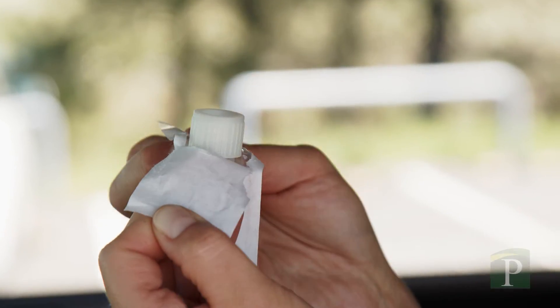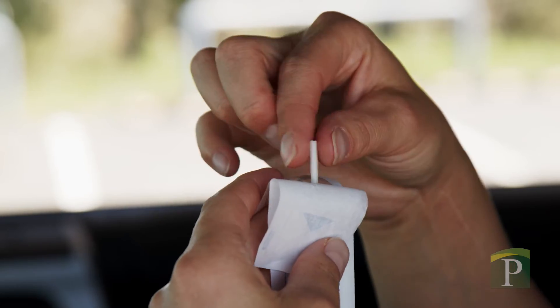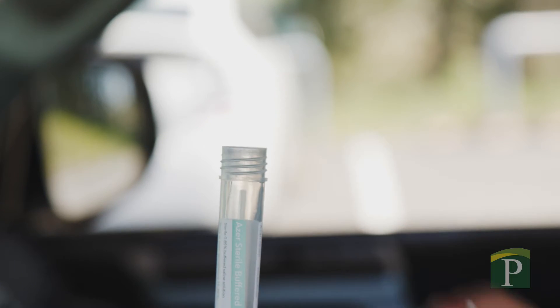Next, open the small plastic tube in your testing kit. Be careful not to spill any of the liquid inside. Put the cotton end of the swab into the tube, then gently break off the end of the handle at the crease.